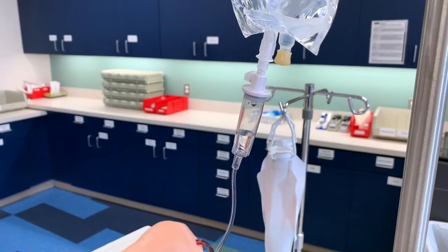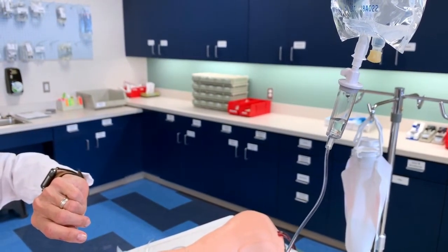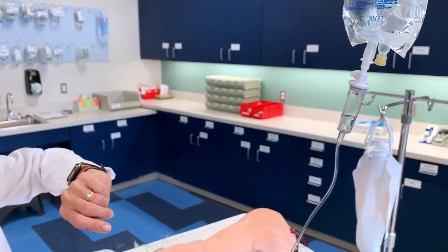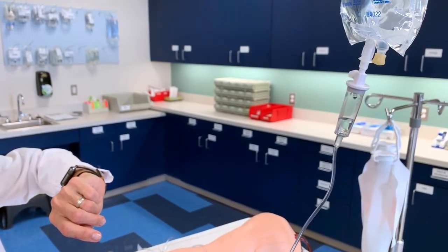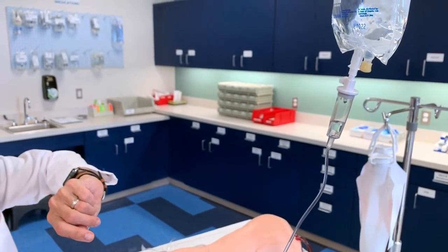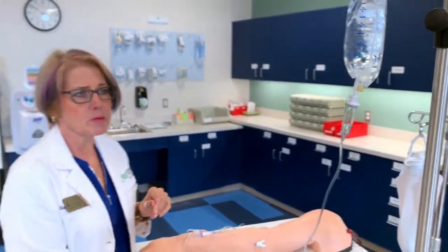So you wanna be watching your watch and just playing with the dial to try to get you to about 6 drops for 15 seconds. And that looks about right. So when we have about 6 drops for 15 seconds, that's going to end up being 25 drops per minute, which will equal out to 100 milliliters an hour using this drop factor.